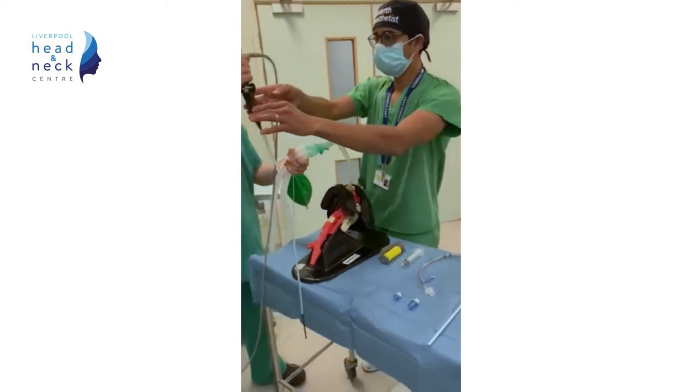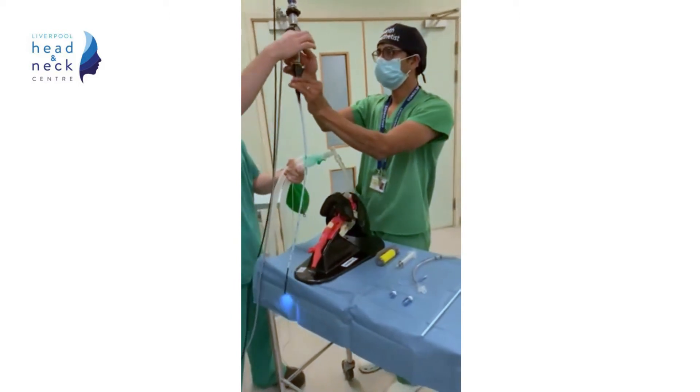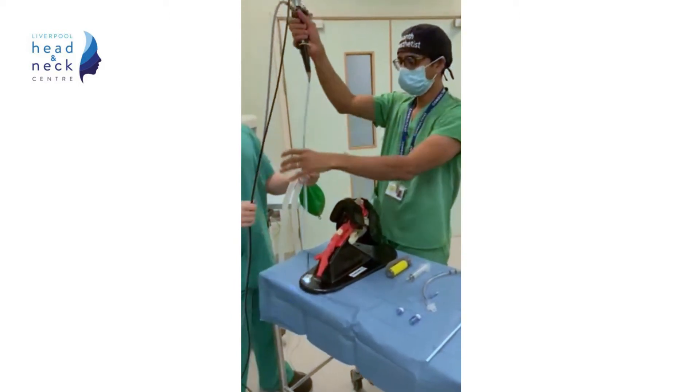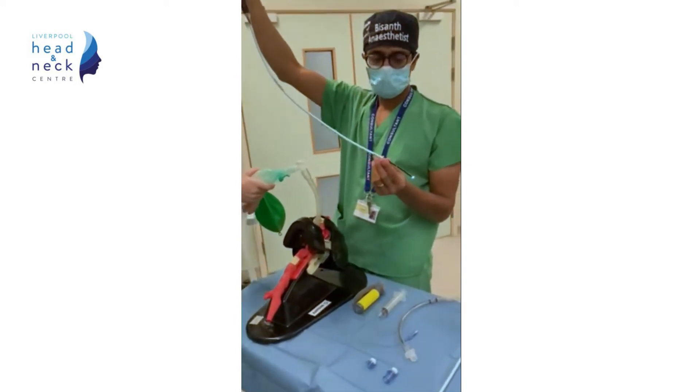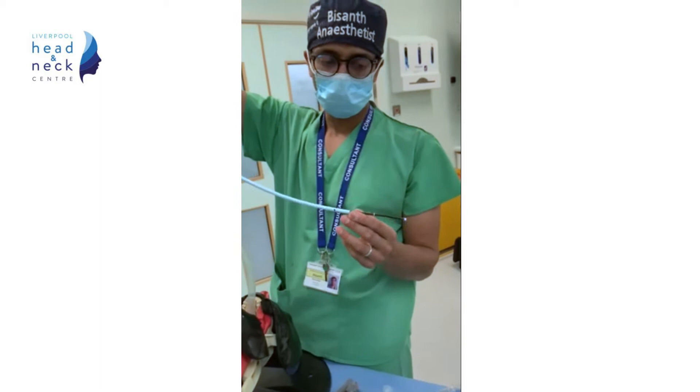The Aintree catheter is already mounted and secured with tape to the fibroscope. You can see that as the Aintree catheter is only 56cm long, the end of the fibroscope is uncovered and can be manoeuvred.